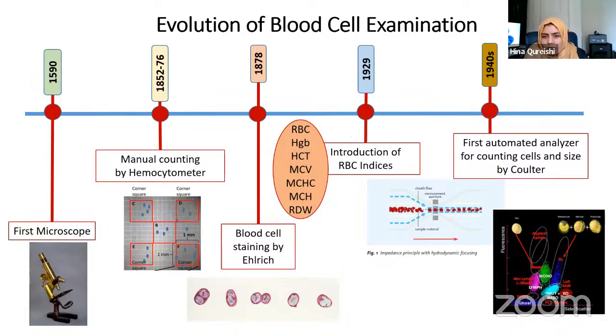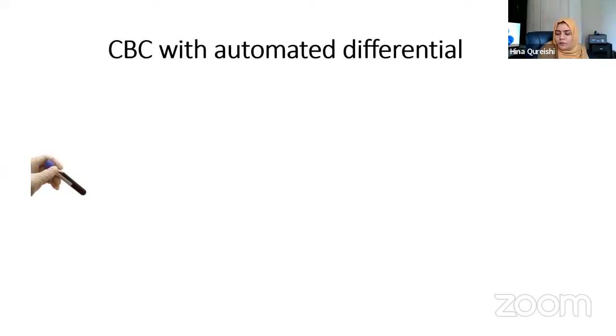Most of this is done for red blood cells and platelets, and usually you get what is called an RDW, which is red cell distribution width. It gives a range of red cell size along with the red cell count. Now, in the new hematology analyzers, we have flow cytometry technology in which fluorescence is used, and also different antibodies are used to develop plots and separate the cell types based on their size and their fluorescence. We're able to look at the cells based on their fluorescence, whether these are basophils, lymphocytes, or monocytes, and they all scatter in different areas of these plots. This technology is used very commonly now in hematology analyzers. So that's just a basic overview of the technology.